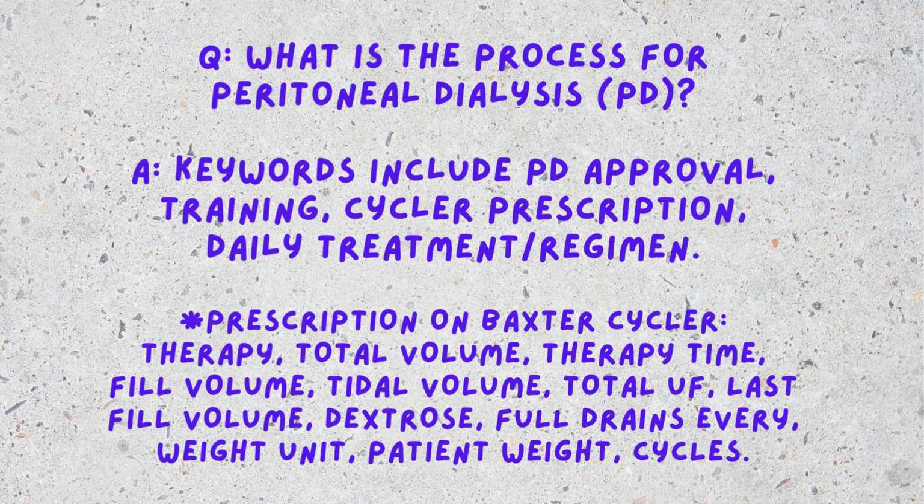Peritoneal dialysis is gentler on the body, it doesn't involve blood, and you need to do it every day. That is the medical advice. So if you choose not to, that is up to you. But of course, the medical team would never advise you to take a day off.